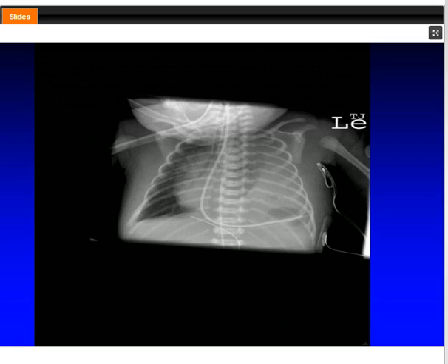Over the next 12 hours, we were able to wean the FiO2 down. And after that, we were actually able to wean the mean airway pressure down a little bit also, but we did not go below 14 because we recognized that when you went below 14, that created a problem for the patient.